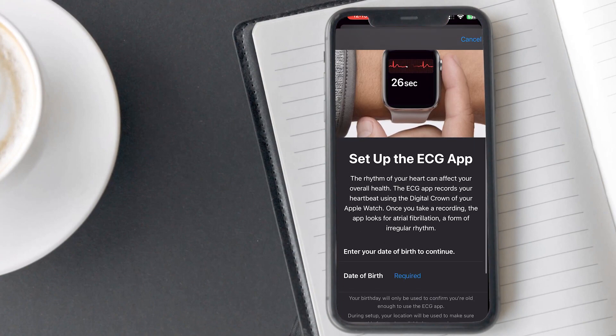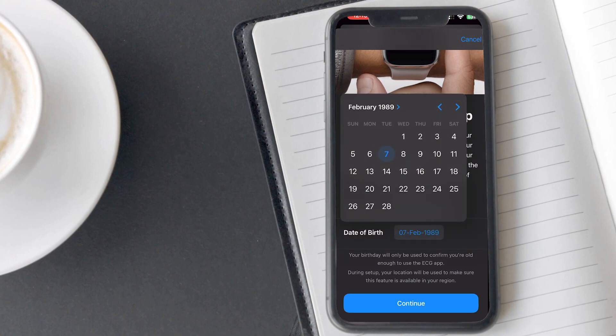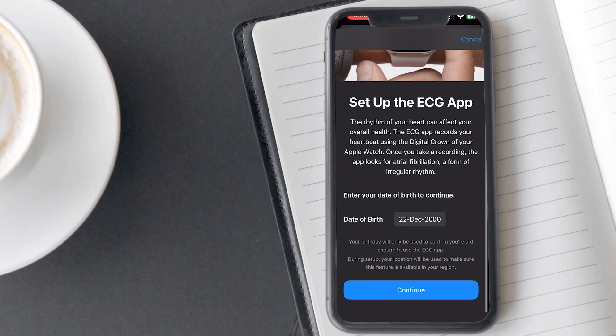Tap on the setup button. Here you need to enter your date of birth because ECG is only for users who are 22 years of age or older. After entering your birth details, tap on continue.